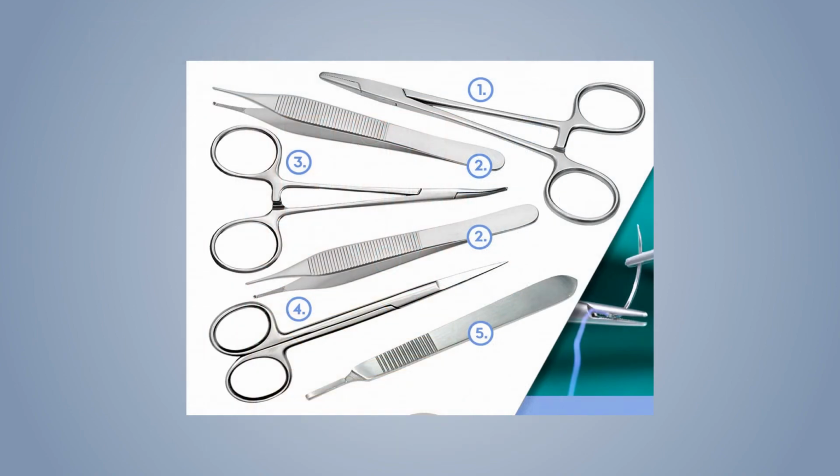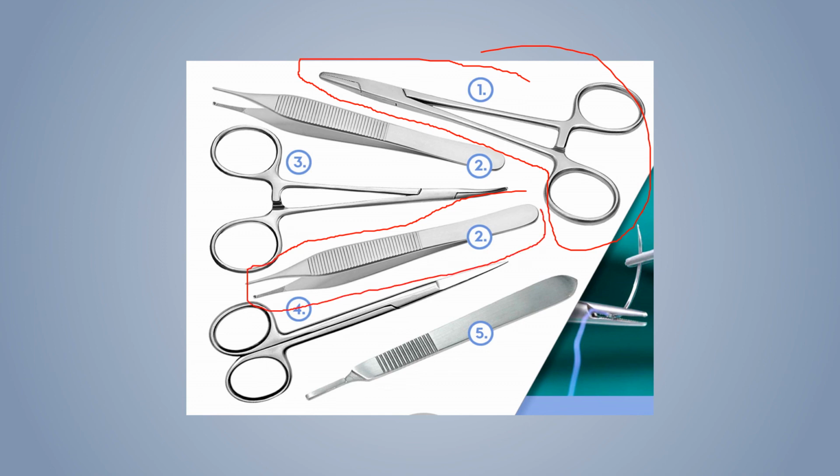All right, I want to review the different tools. So we have here this number one. This is your needle holder, okay? You'll notice it's blunt here. It has locking here. All right. Two, and you have two of these. These are your Addison's forceps. Three is your mosquito forceps, and you'll know that the mosquito is that nice curved here, as well as a locking mechanism here.